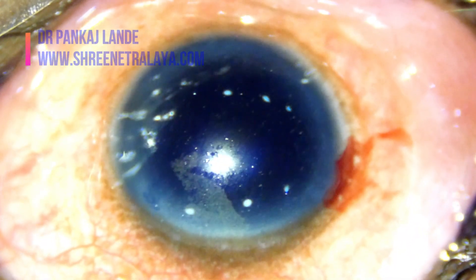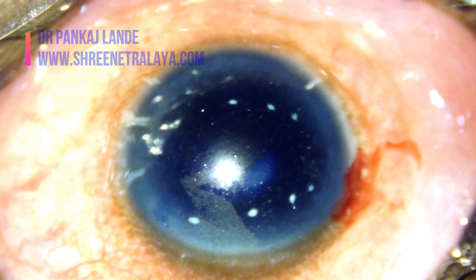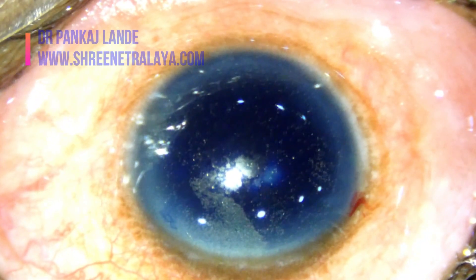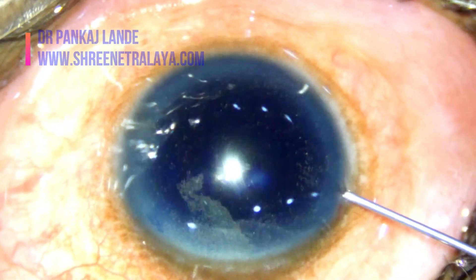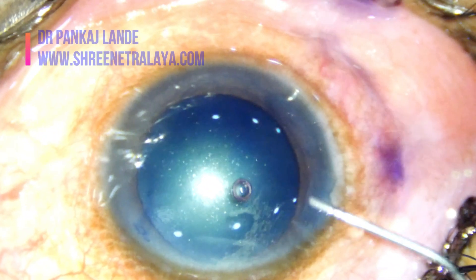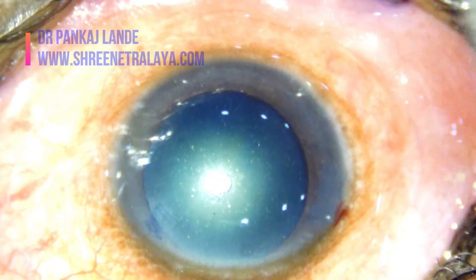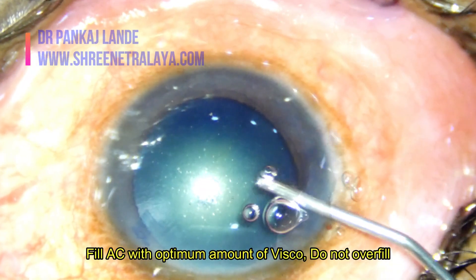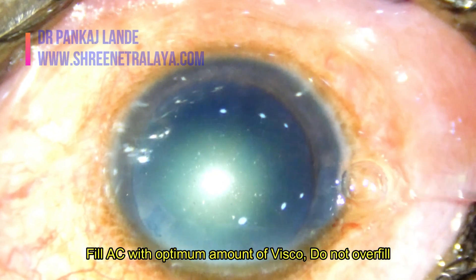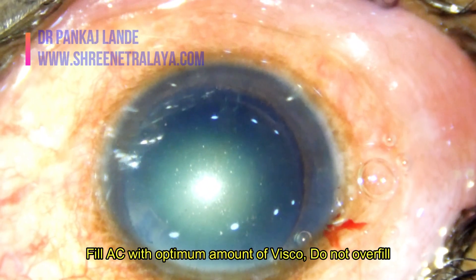Let's watch each step separately. Perform a very meticulous pre-operative examination so as not to miss any lens damage or posterior capsule rupture due to previous vitrectomy surgery.